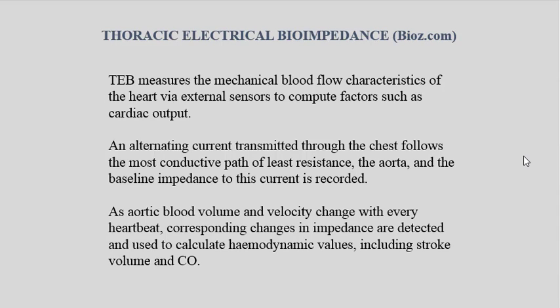Next non-invasive technology is thoracic electrical bioimpedance, called the BioZ.com. TEB measures the mechanical blood flow characteristics of the heart via external sensors to compute factors such as cardiac output. And by sensors, we mean giant ECG leads. You'll see a picture in the next slide.